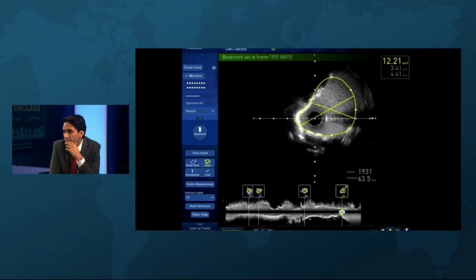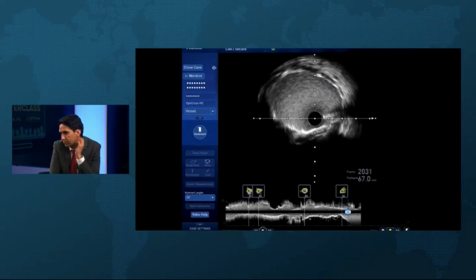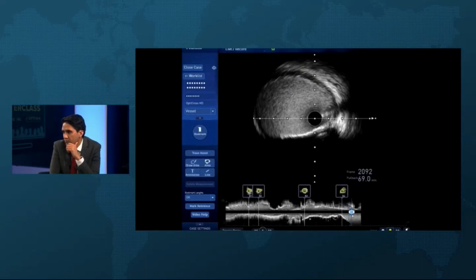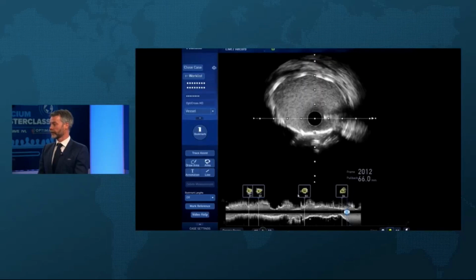That's pretty respectable. Well done. Somewhere around about 11.5, 12 for the ostium. So time for a final angiogram, because I think Claudia has been post-dilating whilst you've been walking us through this IVUS, Margaret. And the front end of the stent looks perfect. Transitions really nicely. Perfect. Lovely.